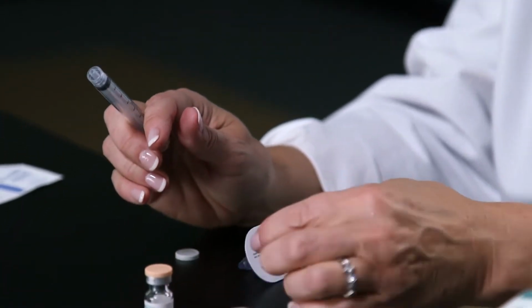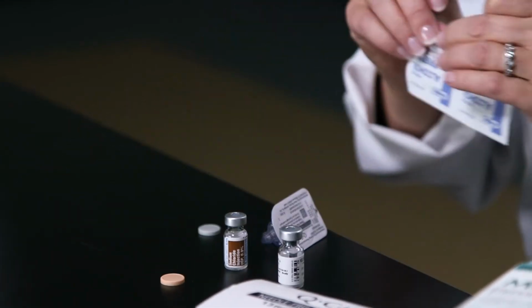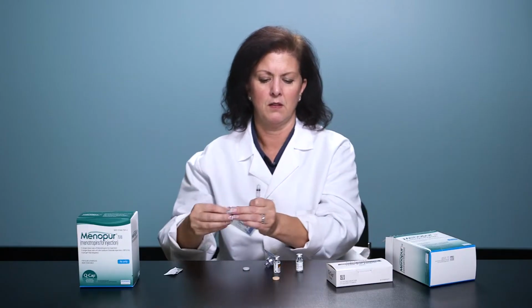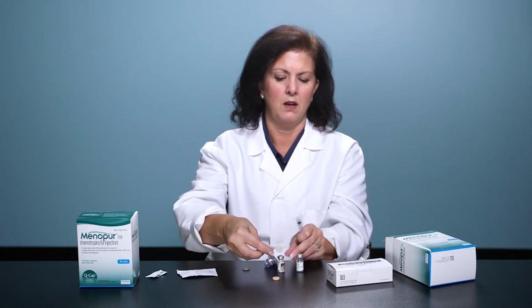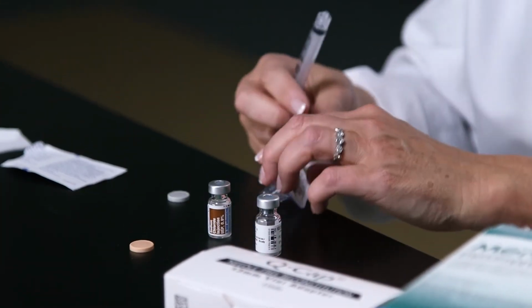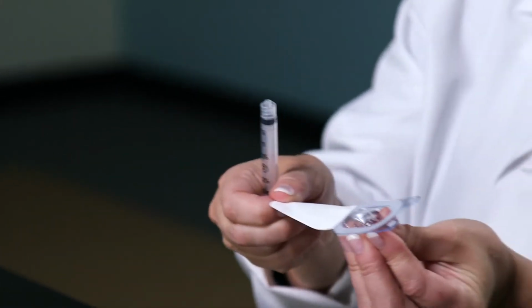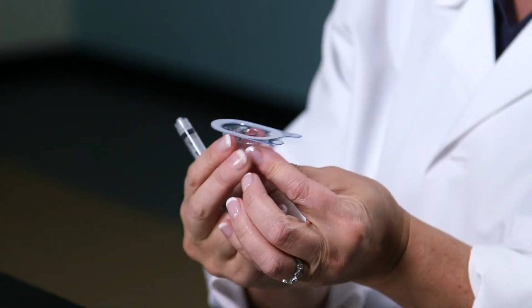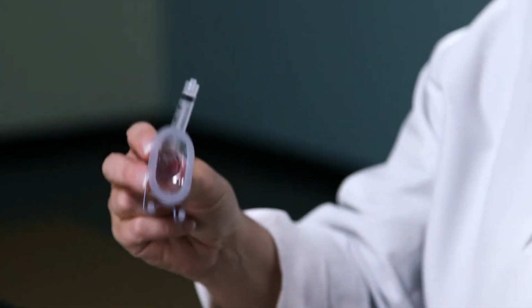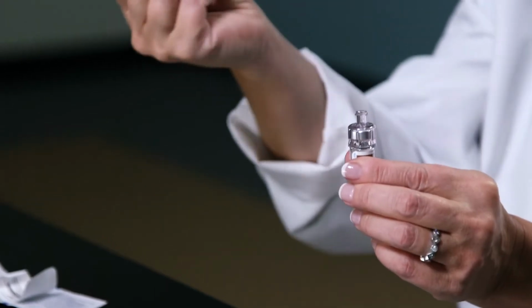Flip off the caps of your Menopur and sodium chloride. Alcohol wipe the tops of each vial. Then peel the paper backing off of the Q-cap, and holding it by its plastic lidding, you'll snap it right on top of the sodium chloride vial. Then you can throw the lidding away.